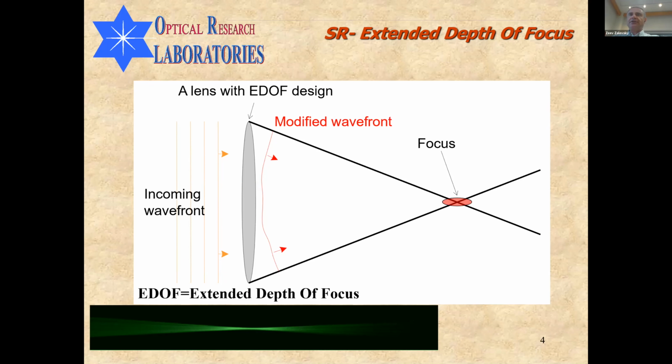In diffractive technologies, you generate structures on the surface of your lens. Those are diffractive structures, which means they cause the light that passes through them to be affected by the diffraction effect. This happens when the fabricated structures have dimensions more or less the size of the optical wavelength. The advantage of diffractive optical solutions is that they are flat. They are fabricated only on the surface of the lens, but the disadvantage is that they have aberrations like chromatic aberrations, so the colors are distorted in the image you gain.